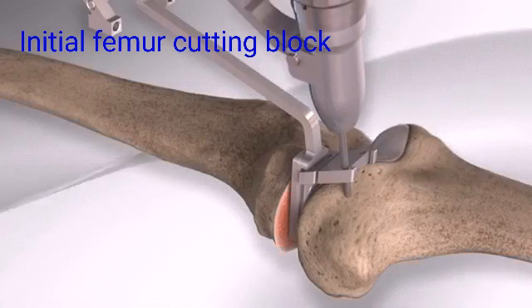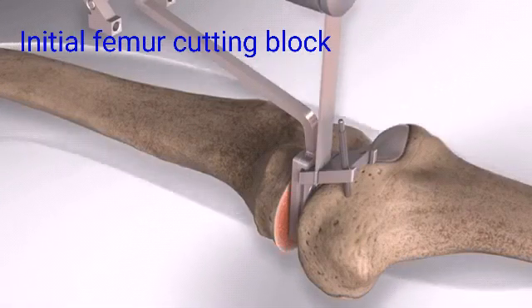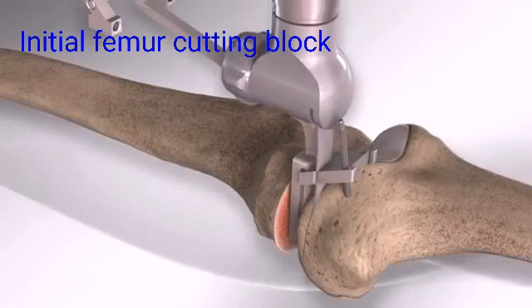specialized linked cutting guides are secured to the femur to remove only the diseased portion of the bone, to prepare the femur prior to sizing the implant.